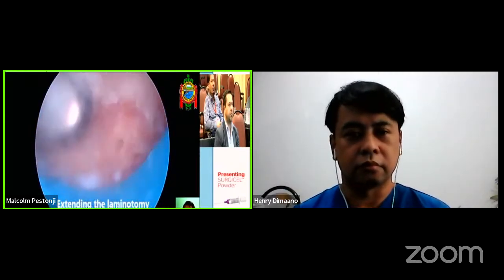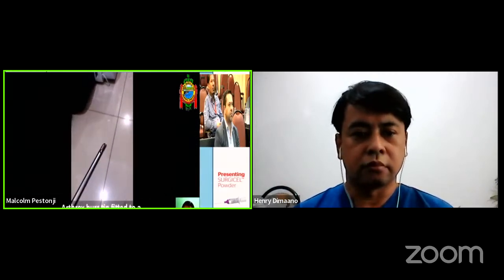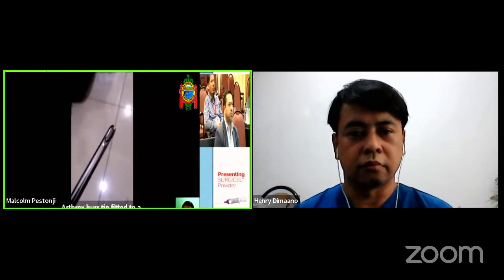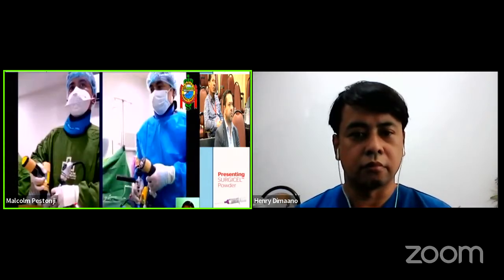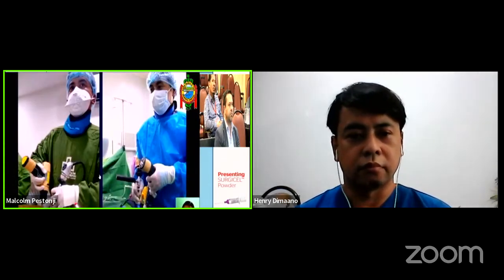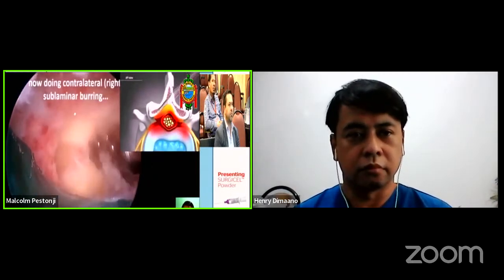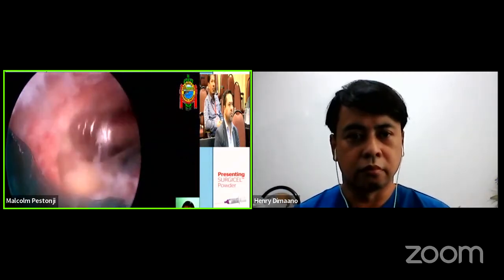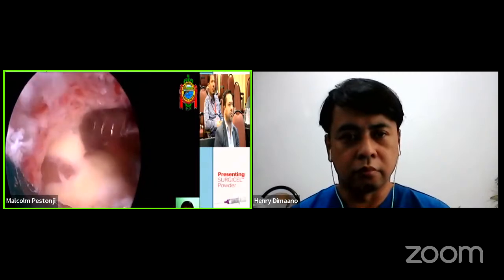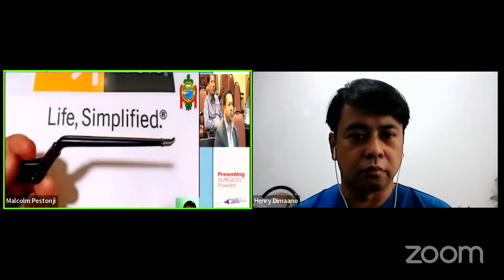It's not as fast, but it works. It does the job. Another adaptation would be to take an arthroscopic burr bit or arthroscopic tip, modify it, put it into a hand drill, and basically use the hand drill as your power source. This is basically that arthroscopic tip being used for ULDD. And again, it's not as fast as a high-speed power unit, but it basically rotates, it powers the burr. So you can definitely take bone with it.